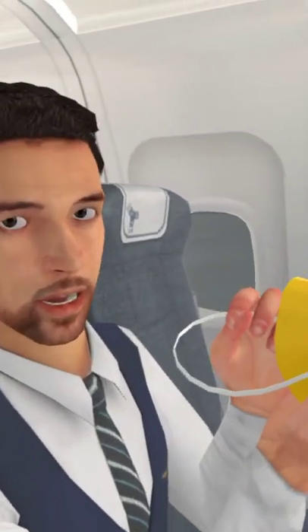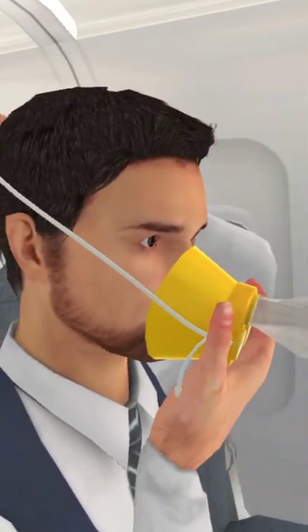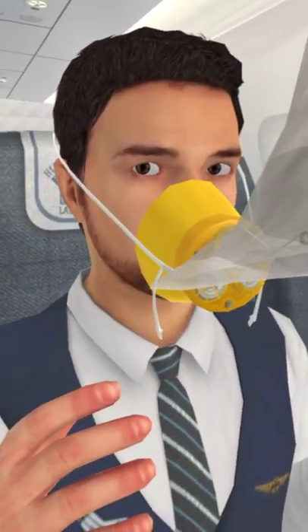Place the mask over your nose and mouth and slip the elastic strap over your head. Pull the ends of the strap to adjust the mask.